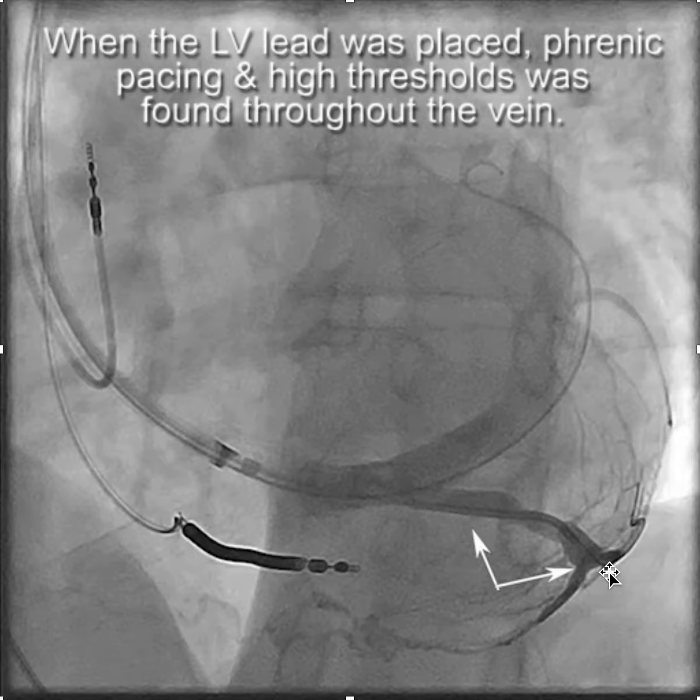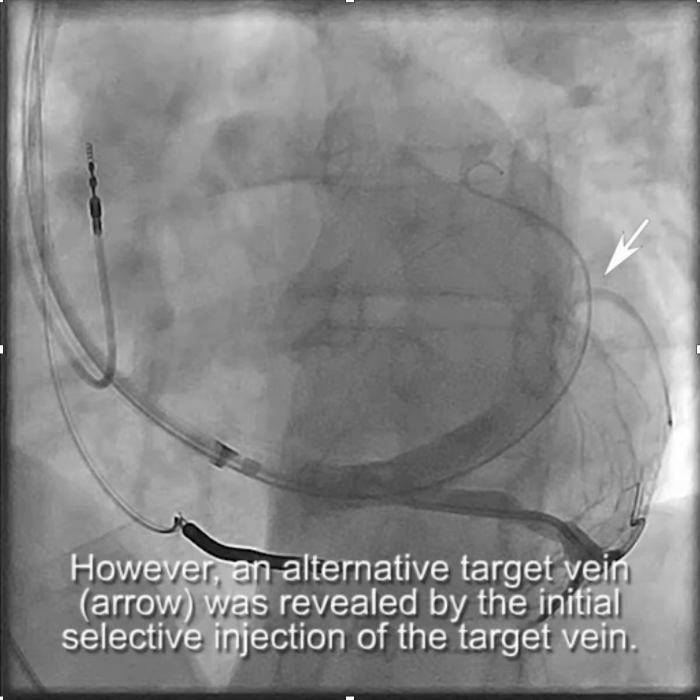There were high thresholds all along the vein despite using a quadrupolar lead and positioning the lead in the various branches and sub-branches. But fortunately, we noted that there was an alternative target vein identified by the initial injection of contrast through the vein selector.